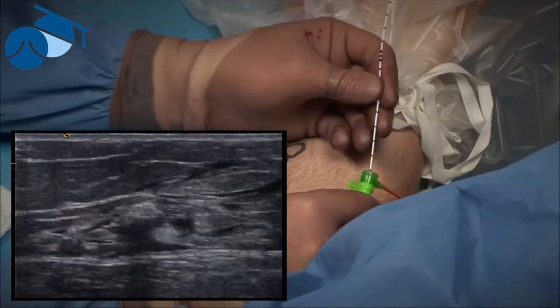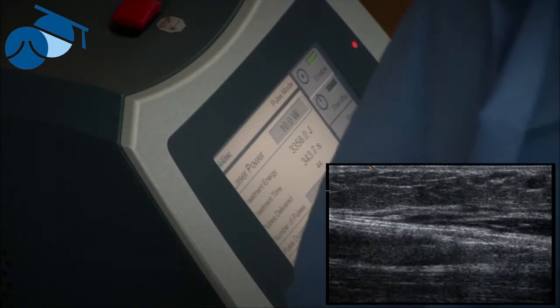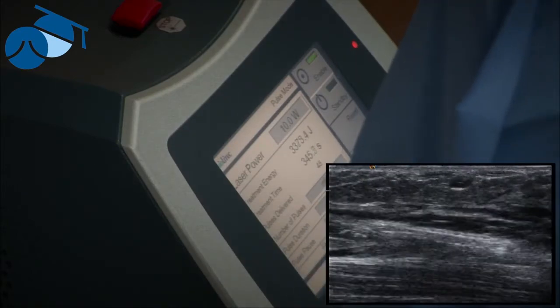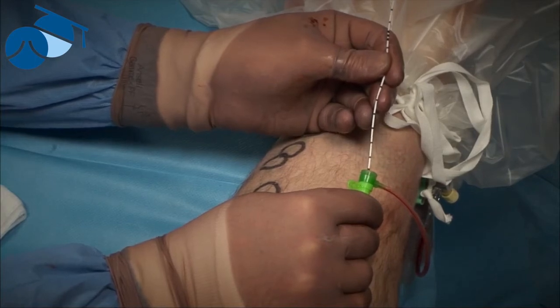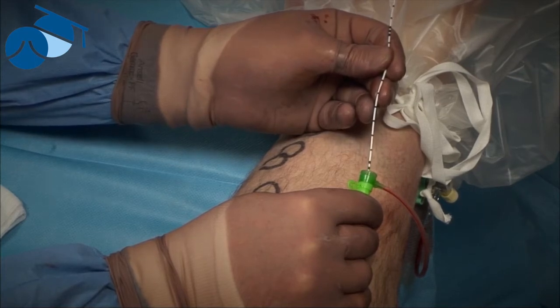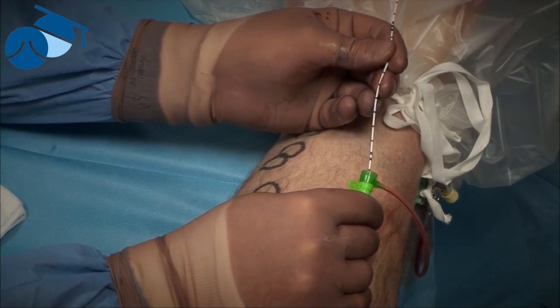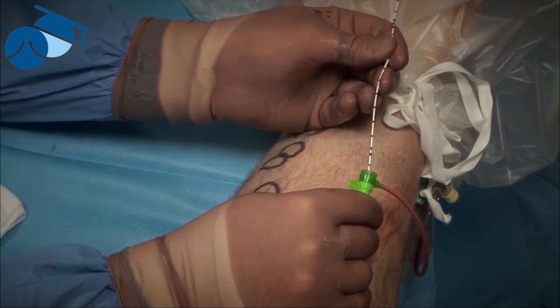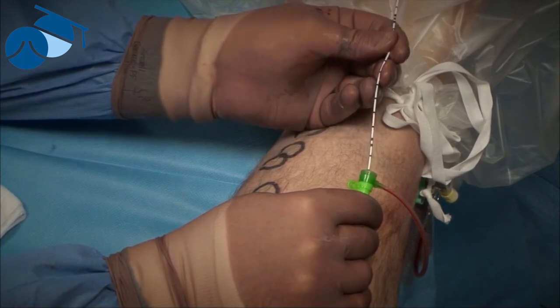Every new device I've seen so far that has come out initially saying that you can use less energy per centimetre has had to revise itself, usually within a few years because of poor results. So there does seem to be a universal truth that for thermoablation you need to have, for a great saphenous vein, between 60 and 90 joules per centimetre. Less than 60, you don't get closure. You get thrombus, which then reopens in the longer term, so it may be reported as closure because of the thrombus, but it will only reopen when that thrombus resolves.